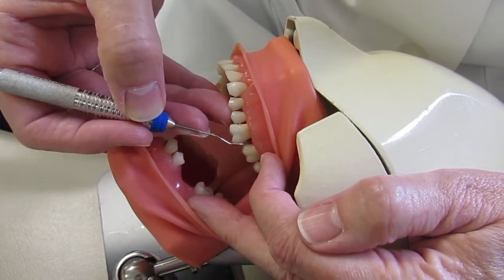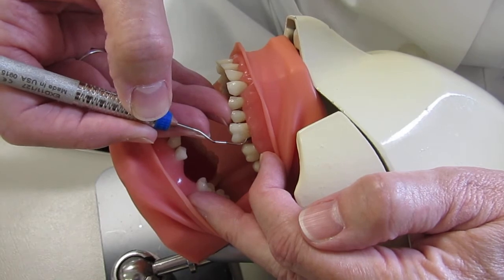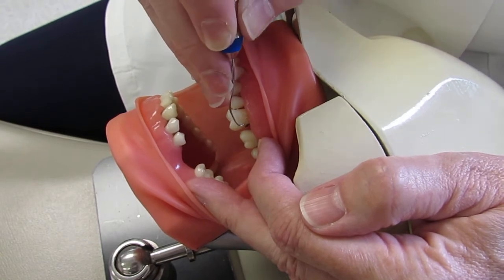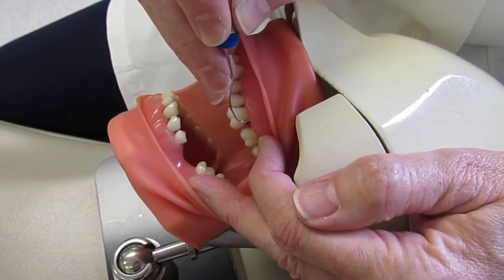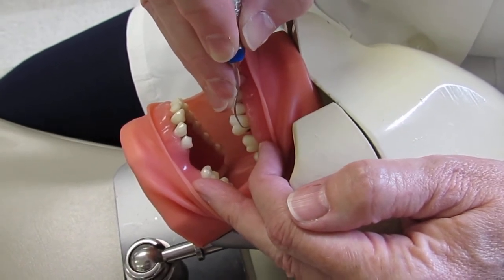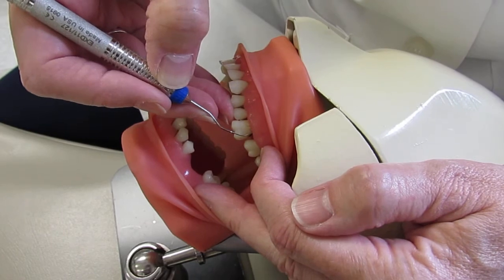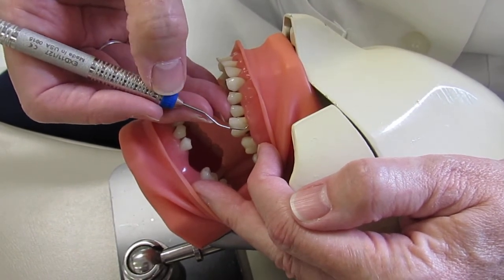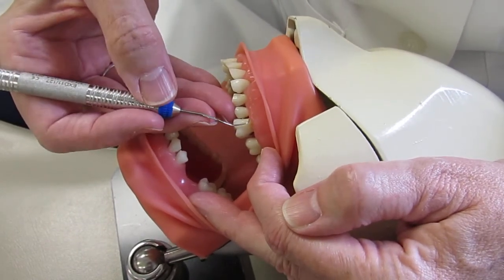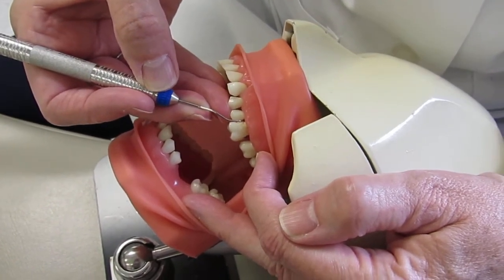Come out, quarter turn, and now on the opposite lateral side. Position in the get ready zone, pivot for insertion, coming up pretty horizontal so the entire working end is parallel to that tooth. Insert, come behind the line angle so you don't miss it. Then get a little oblique in stroke direction, walking across that tooth with a very light grasp, rolling, getting tall on the fulcrum, going halfway across until the terminal shank is parallel to the tooth.